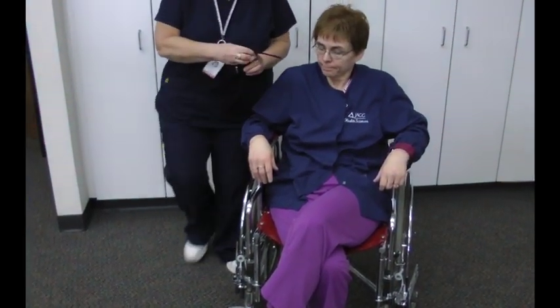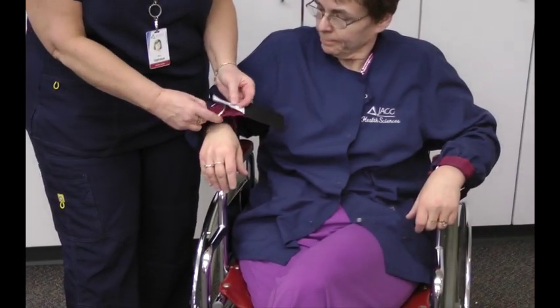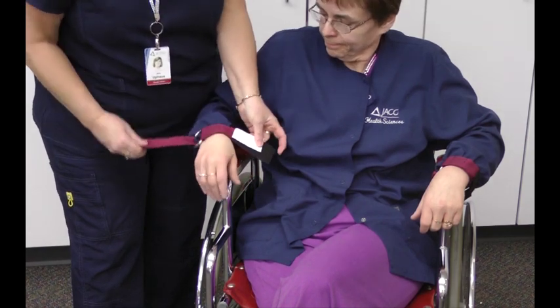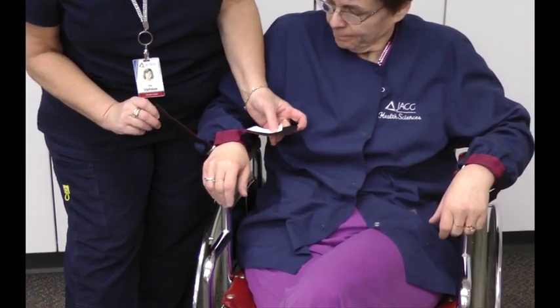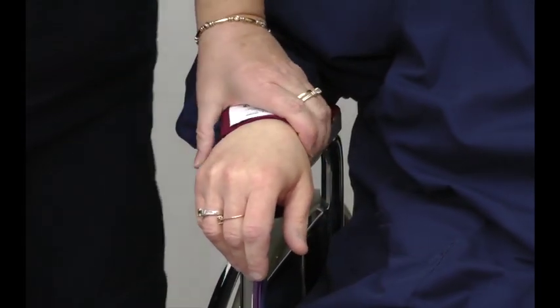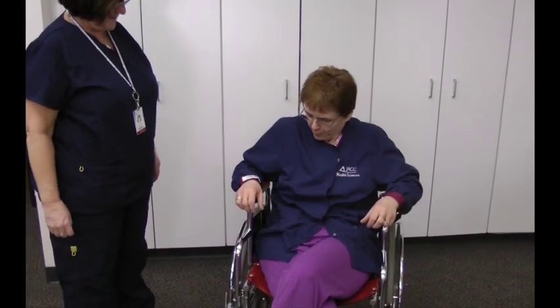I'm going to come around here. I'm going to apply this one. It goes through the ring. And then you're just making sure that the stickiness of the Velcro is sticking. Okay, Melissa, go ahead and try to lift your arms up. You're pretty restrained, aren't you? There you go.